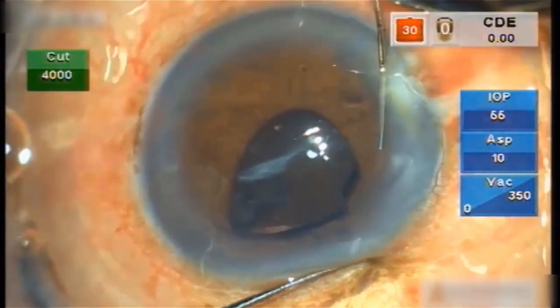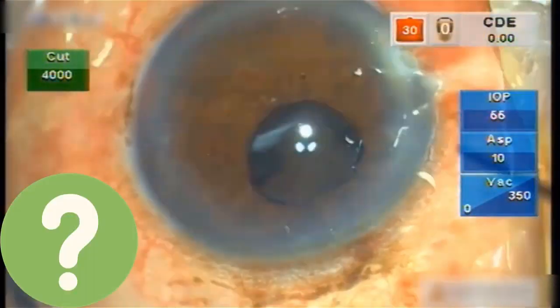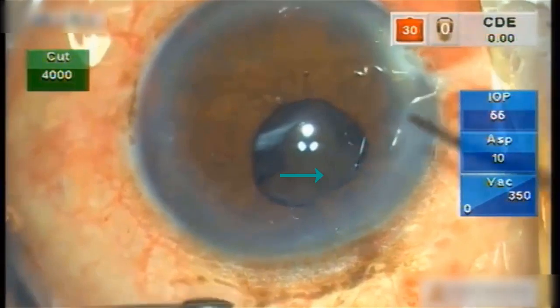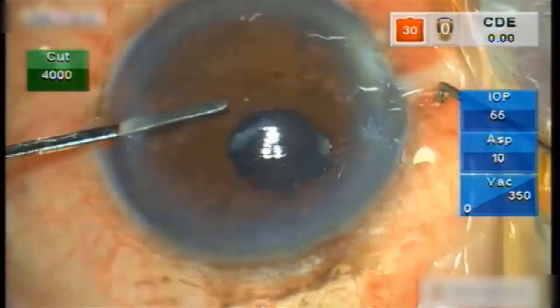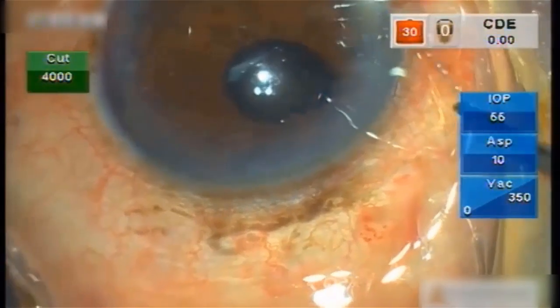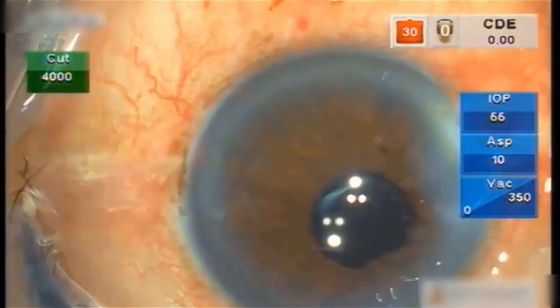The suture bite was taken in such a way that it passes below the haptic. It looks like a blind procedure — how do we know the bite has gone below the haptic? While pulling the suture, if the optic moves along, it confirms that the bite has gone below the haptic. Both suture ends are trimmed and externalized through a paracentesis with the help of a Kuglen hook. The suture ends are tied together so that the knot lies over the iris and does not crush it, and it is finally trimmed and placed in the anterior chamber.